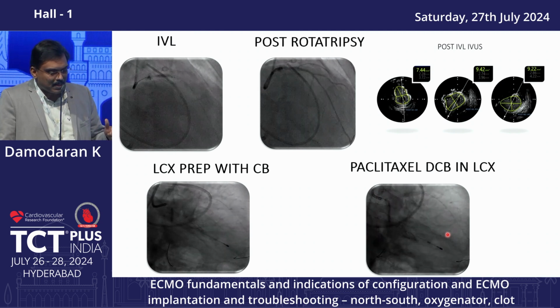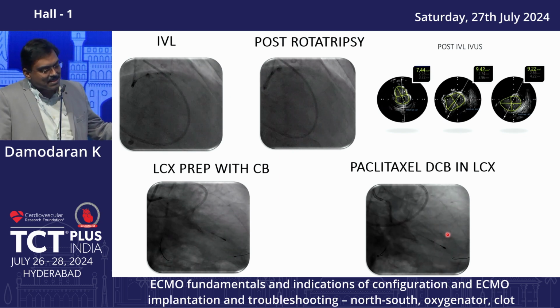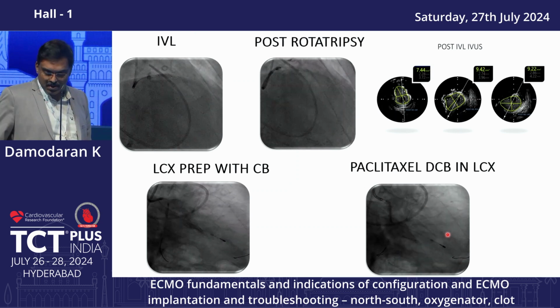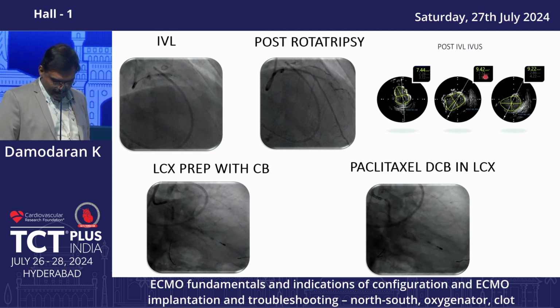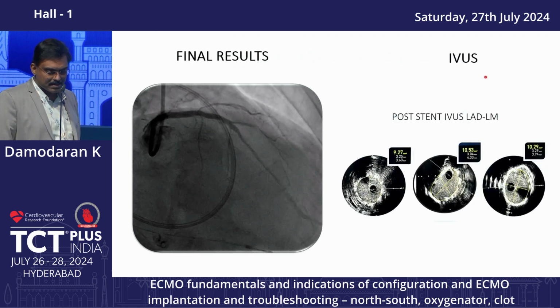So he didn't develop any sudden arrest. He developed slow hypotension when we had to increase the flow a little bit at the expense of increasing the LV filling pressure. I could understand, but that one we have managed with the dobutamine and some diuretics. So you can see the post-IVL, there is a nice cracking of the calcium and the area is also more than 9. So then we have stented this, and then I just thought of going ahead with the LCX.